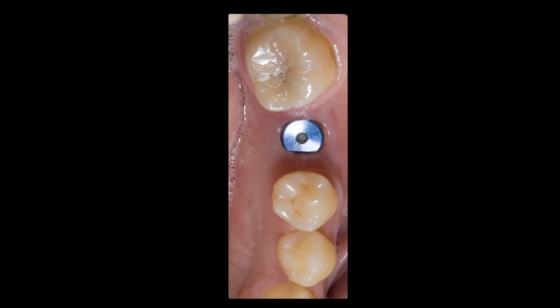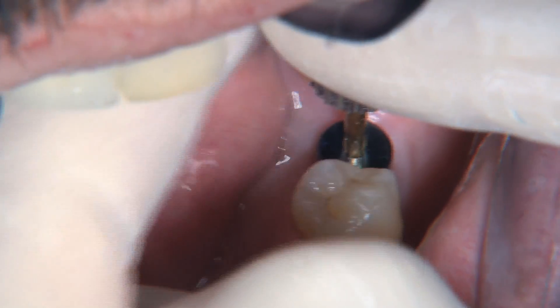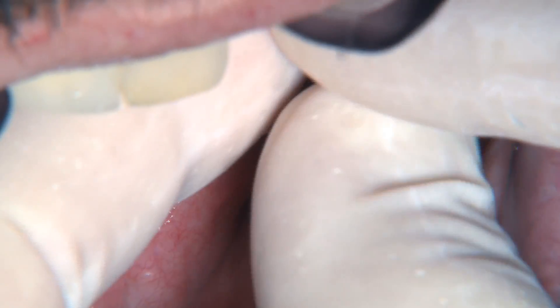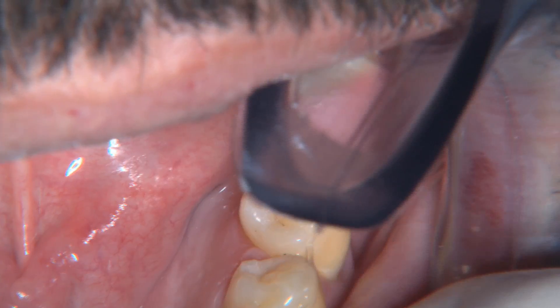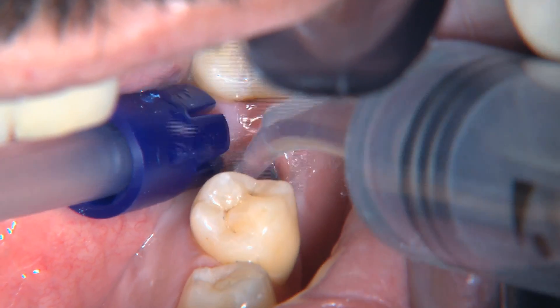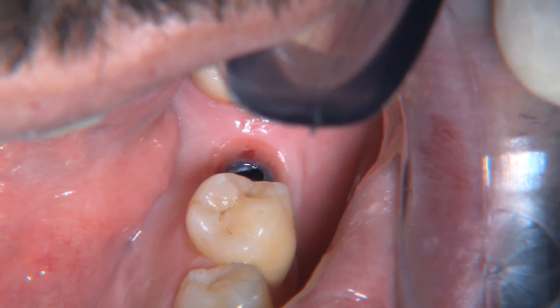At the second appointment, the healing screw is still in place with a little tissue over the mesial portion. We take a diode laser and remove a little of that tissue to make sure it's clear for when we place the abutment. Using the hand wrench, we unscrew the healing cap and look around to confirm everything looks as it should. Then we do a quick chlorhexidine rinse as an antibacterial measure and to clean out any debris that may be around the implant.